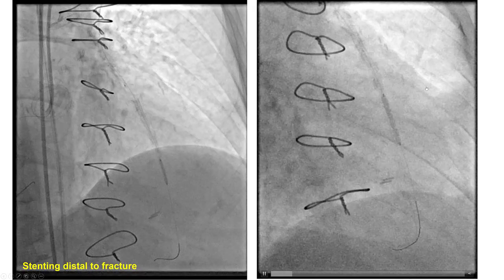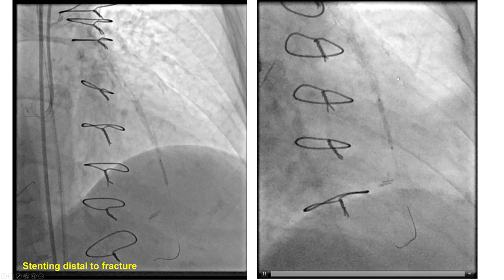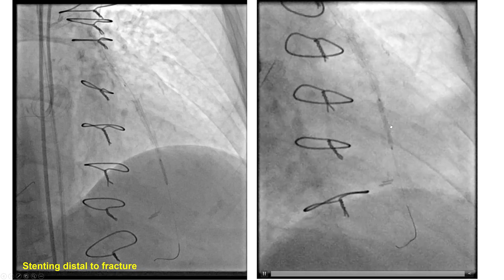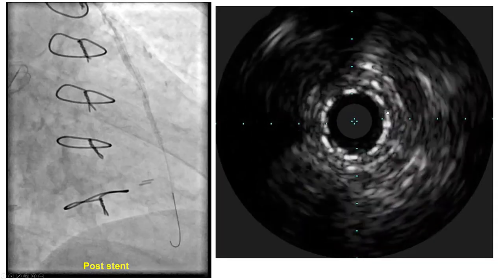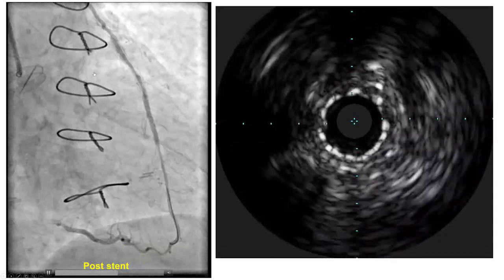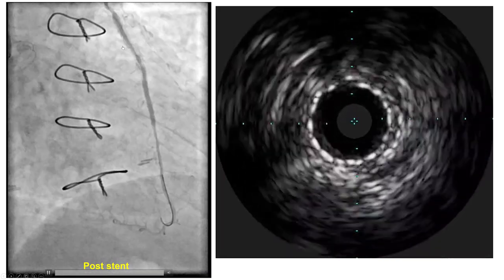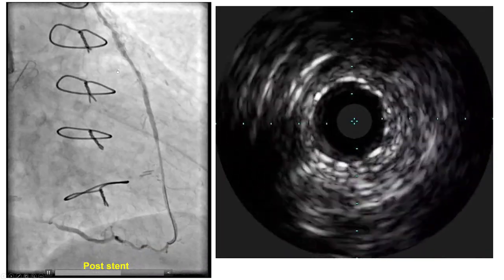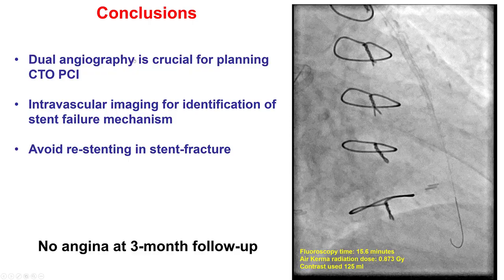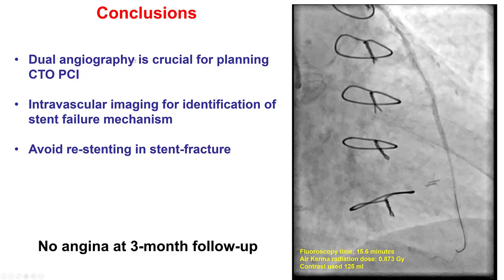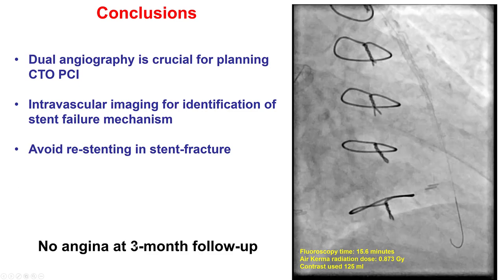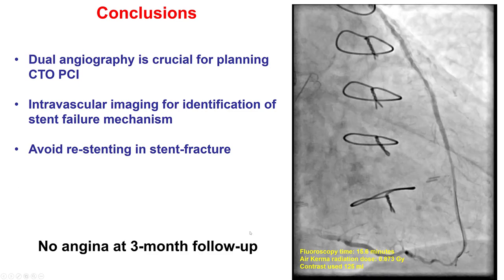The highest-grade lesion was not at the site of the fracture but more distal in the native vessel. That is why it was treated with one drug-eluting stent, providing a nice final result as confirmed by IVUS. We then performed balloon angioplasty of the previously placed Lima stents without placing additional stents. The patient did well and did not have any angina at three-month follow-up.